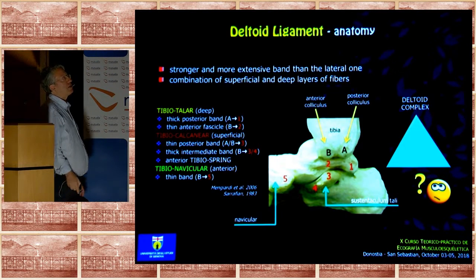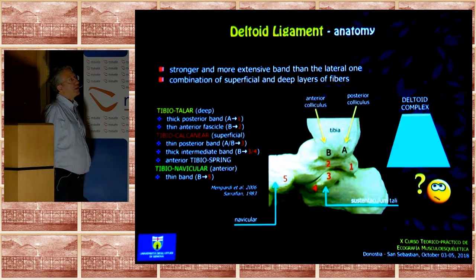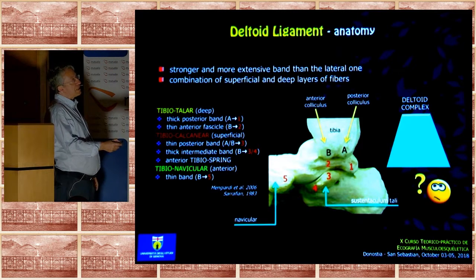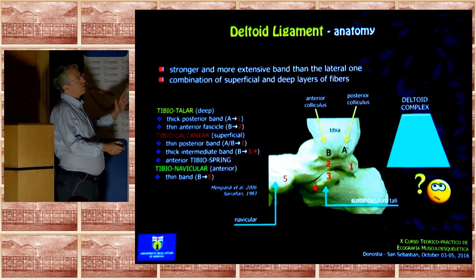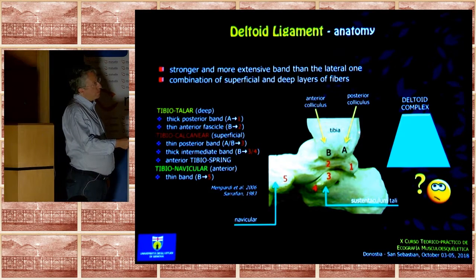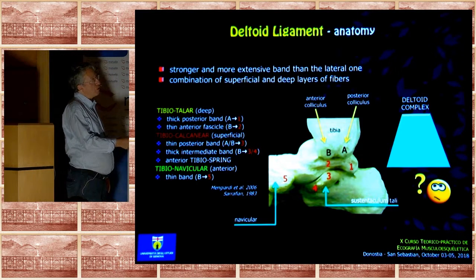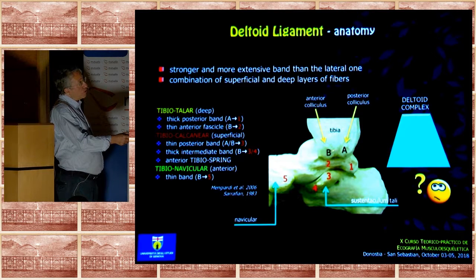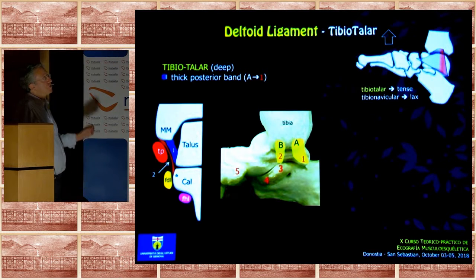This is incorrect because this is the arrangement of the deltoid fibers, and so you have to sweep the upper part of the probe from A to B when you examine these fascicles from posterior to anterior. You have to progressively move the top of your probe from A to B. Remember, this is the trick of the trade to see this ligament better than normal.